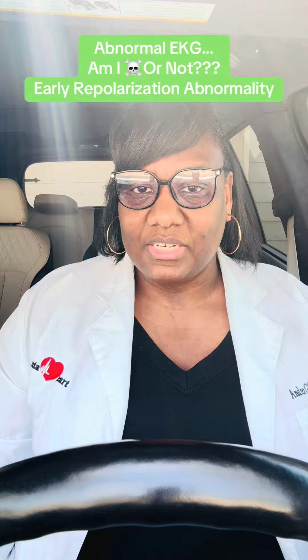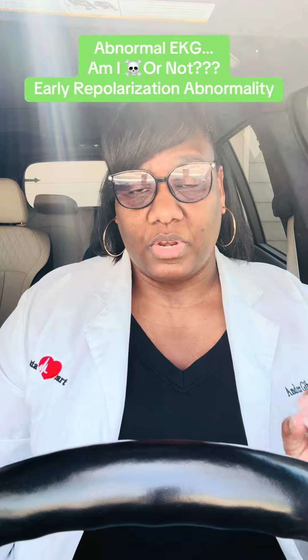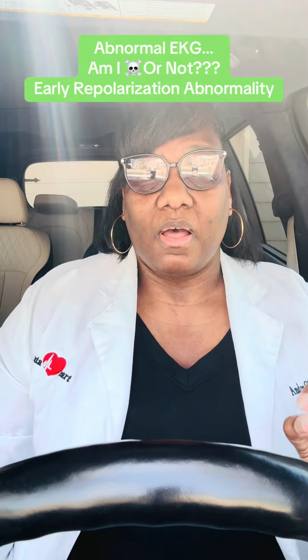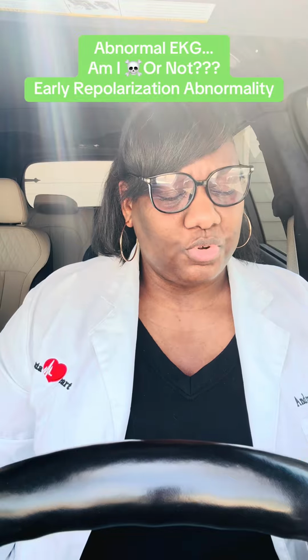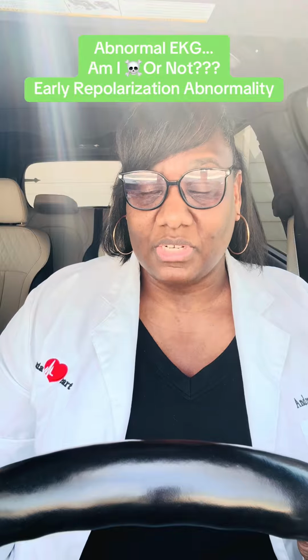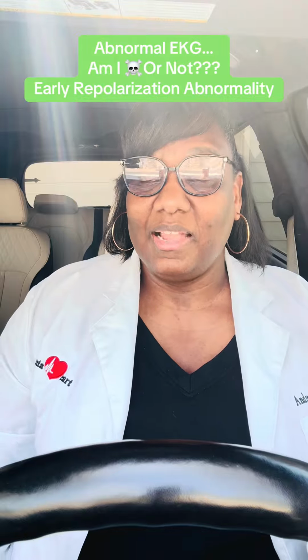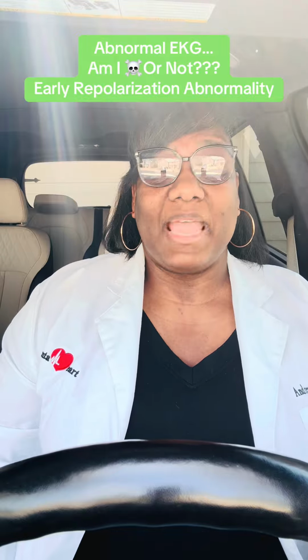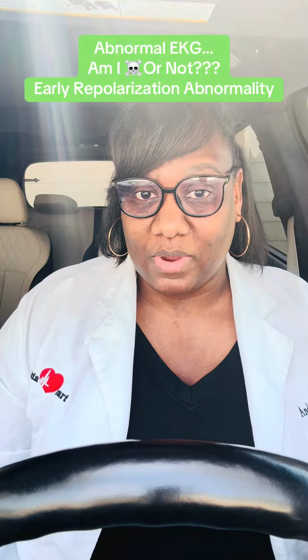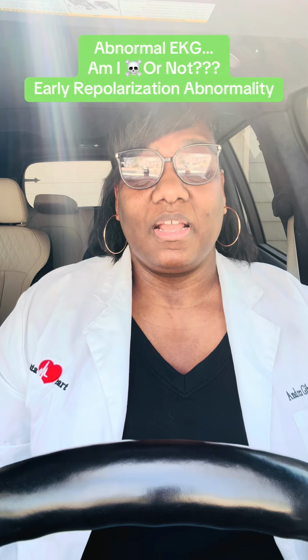Here is another key delineating point between early repol and STEMI. With a true STEMI, you are going to have dynamic EKG changes by way of reciprocal ST segment depression in opposite leads, and you're not going to have that in early repolarization. So, take all of that into consideration.